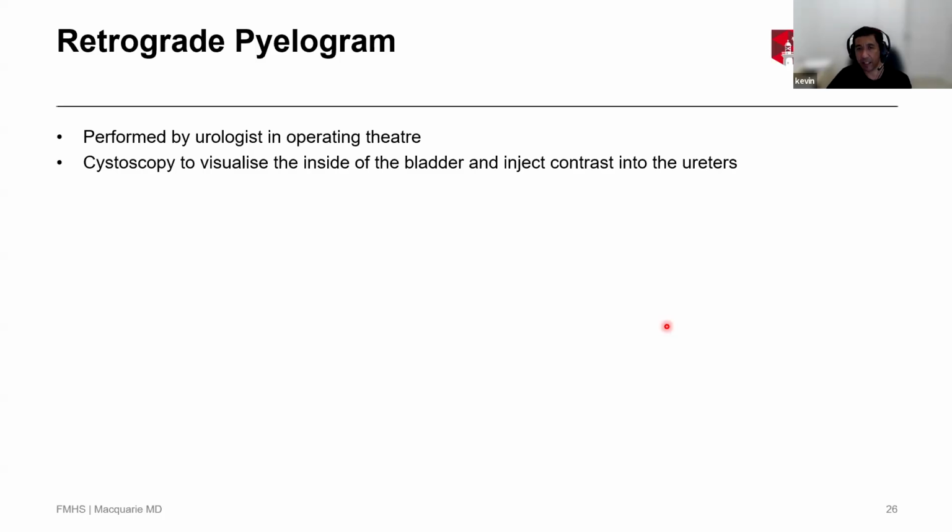If you have a recent cardiac stent, most of them now are MRI compatible, so there's usually not a problem. But if you have something in where you're concerned it might move, so in an aneurysm or something like that, then you have to make sure that it is MRI compatible, or you just have to wait long enough until it gets embedded into the tissue. In terms of gold in the mouth, I don't think gold is ferromagnetic, so it shouldn't be too much of a problem. And if you're imaging the pelvis or the abdomen, artifact caused by distortion of the magnetic field from the mouth is not going to be an issue.